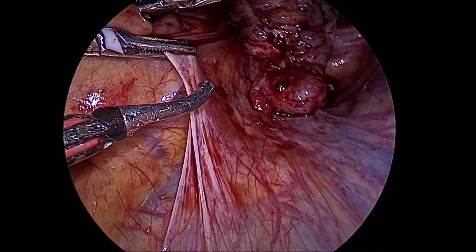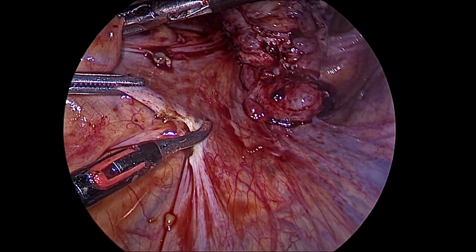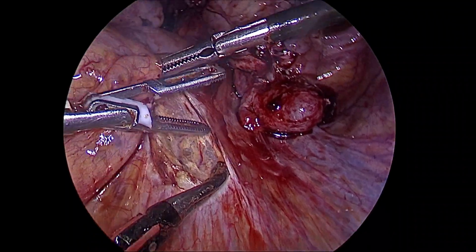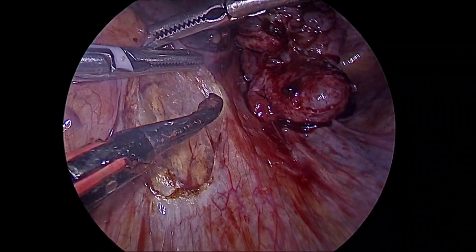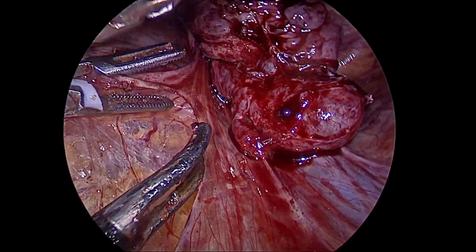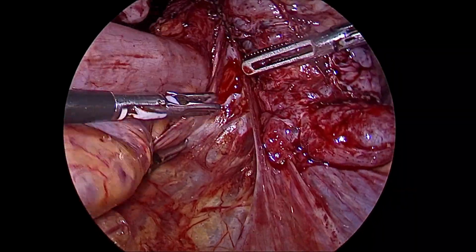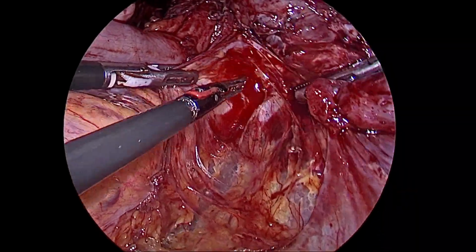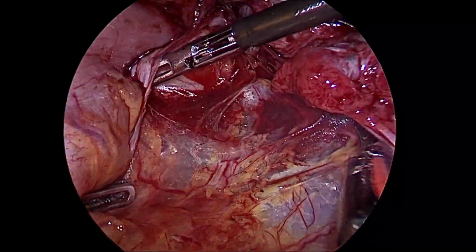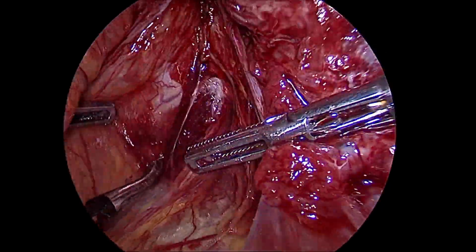Here on the left side, again we start from the pelvic rim, and the ureter was seen very lateral, because this side was relatively uninvolved. So the dissection starts from the sacral promontory pararectally. With the bipolar shearers, we go right up to the posterior surface of the uterus into the POD. Again, small bleeding is there, with just a short current that is controlled, and bleeding is stopped.